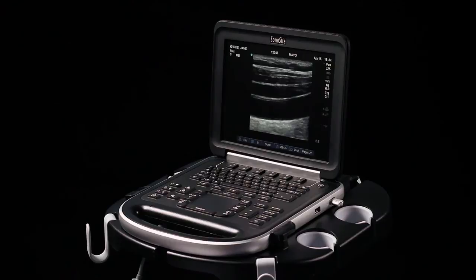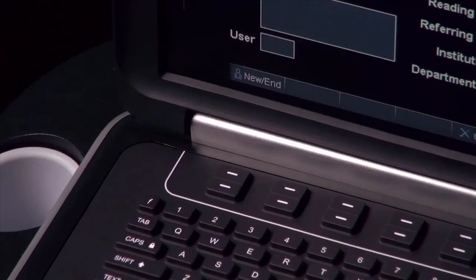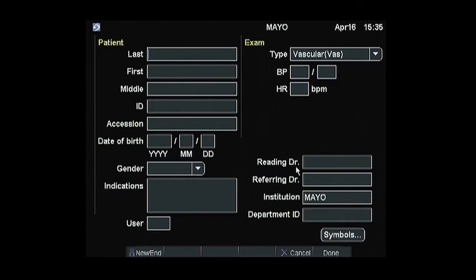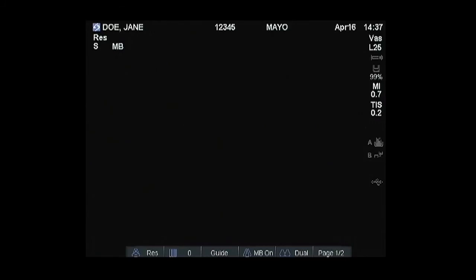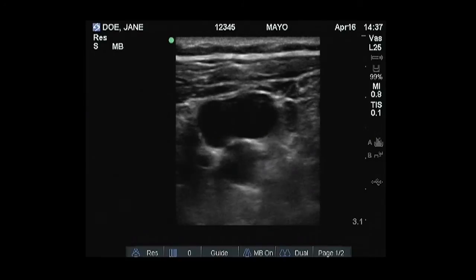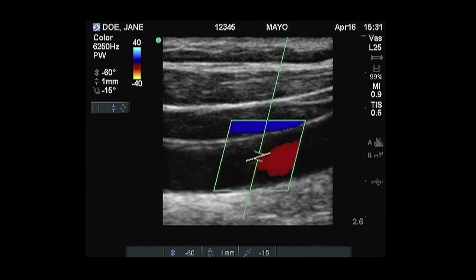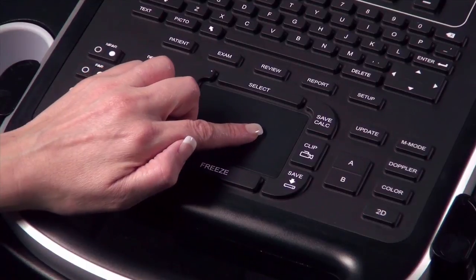When you have acquired all images for the study, press the Patient key and choose New/End Exam from the on-screen menu to finalize the exam and end the study. This concludes this brief review of imaging modes and system controls to optimize the ultrasound image. For an extensive review of system features and functions, please refer to the system user manual.